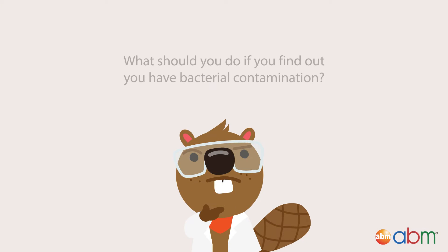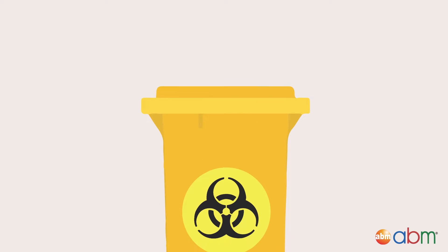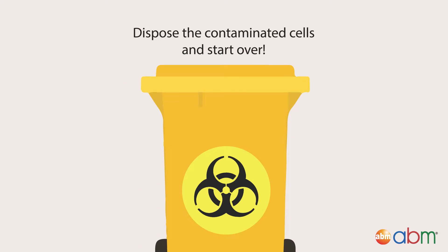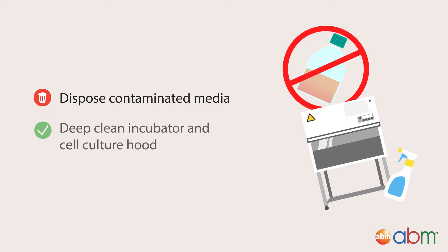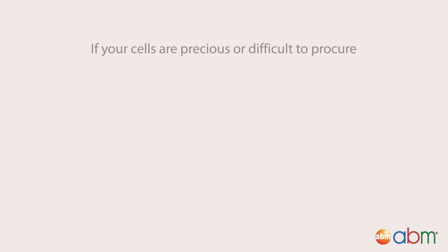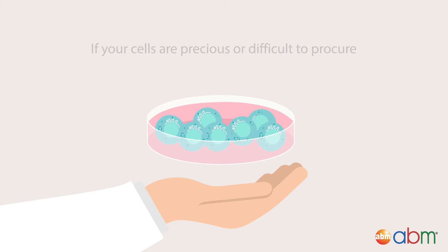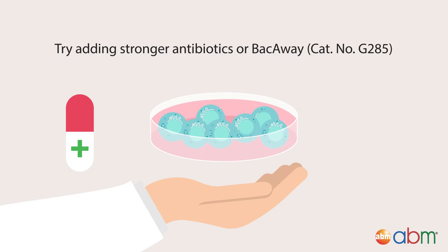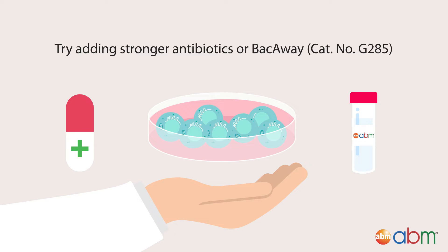So, what should you do if you find out you have bacterial contamination? If you have stock files of your cells, it is best to dispose of your contaminated cells and start over. You'll also need to dispose of your old media and do some deep cleaning of your incubator and cell culture hood. If your cells are precious or difficult to procure, you can try to add stronger antibiotics to your culture to help fight the bacterial contamination.